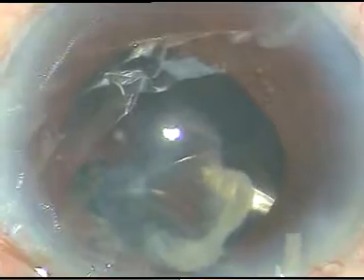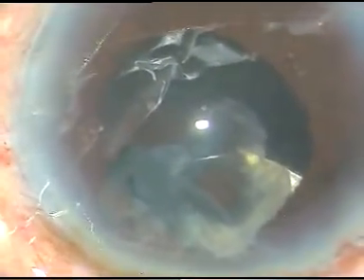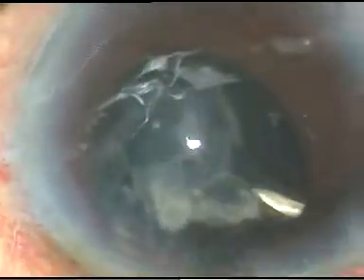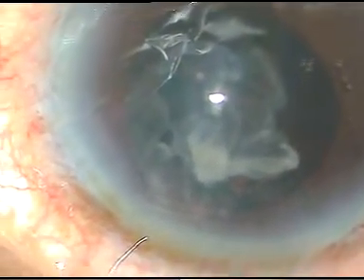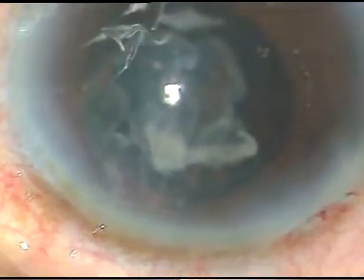I'm still behind and giving some support till this viscoelastic substance is injected. This epinuclear material is now in the anterior chamber, in front of the iris and on the posterior capsule, which is still there, a part of the posterior capsule which is on the left side of the main incision.